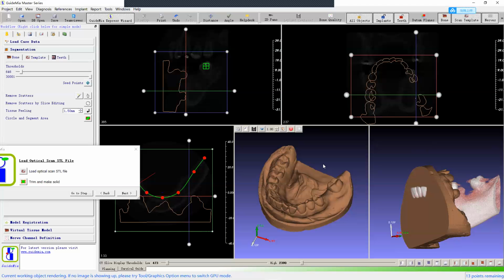So typically, nowadays, I think the most common numbers we have seen are 0.34, and after the interpolation, you get 0.15, something like that. But we do require better resolution, so the thickness shouldn't be more than 0.5.